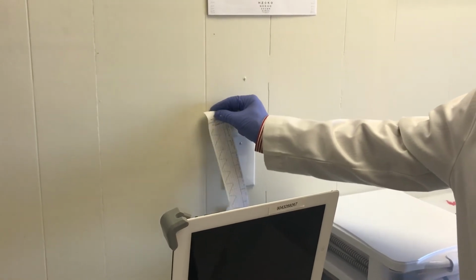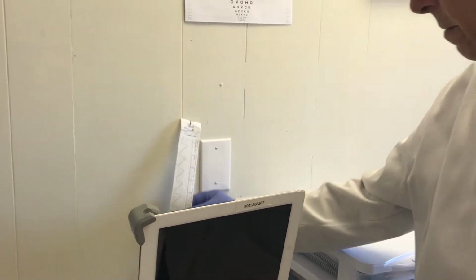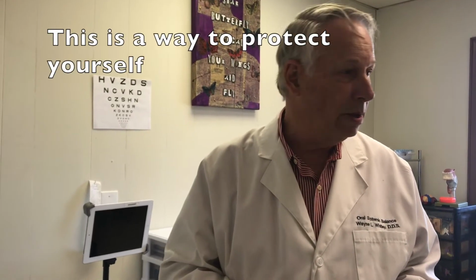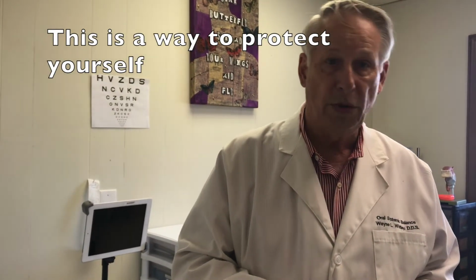And then my Joan comes in after I'm finished with a stapler and staples them all together. And then I have a dental EKG stamp, not for diagnosis, and stamp it on there, because I don't want anybody to think I'm doing cardiac stuff. What I'm doing is balancing oral function, and I'm using this to guide me as to how to balance oral function. And you'd be surprised how much easier it is when you have the assist of an EKG.